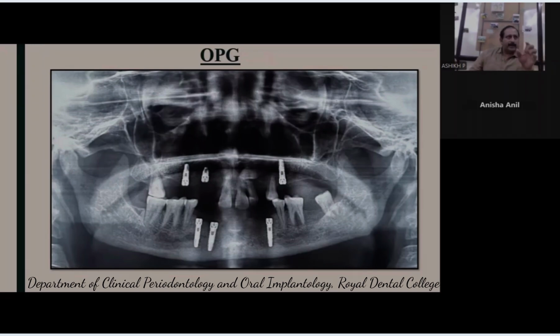So when you extract this tooth, you're not going to have a root intruding beyond the socket into which your implant is to be placed. That thing is not there. So that part you're safe. The roots of this tooth are going to be within the socket you see here.